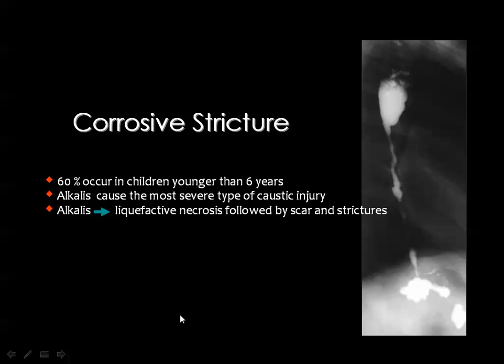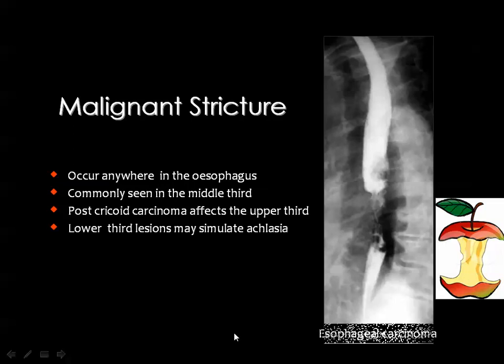And because we are afraid of esophageal perforation, we usually used to give these patients, instead of barium, lipiodol. And this lipiodol is an oily material which is safe if it passes outside the esophageal lumen, just in case there is an esophageal perforation secondary to corrosion. And if we are sure that there is no perforation, we can use barium later on.